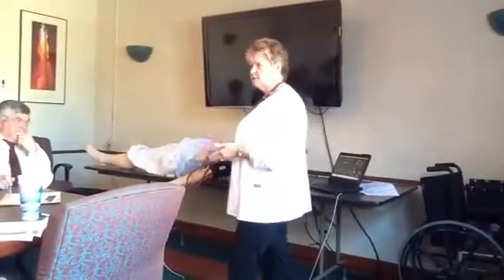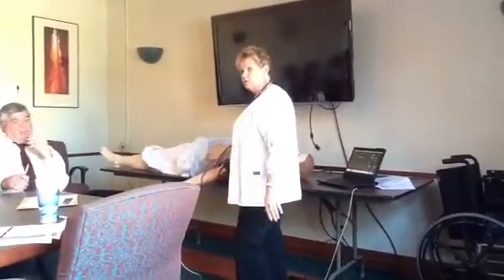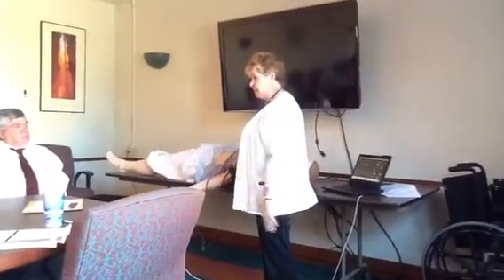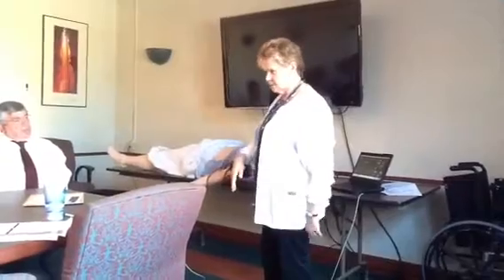So you go through the scenario and you say, okay, when it got to this point, maybe you should have done this. And we can make him respond however the students respond. So if the student does something wrong, Kevin can make the mannequin do something wrong. Like if they give the wrong med, we'll put them into asystole or whatever.